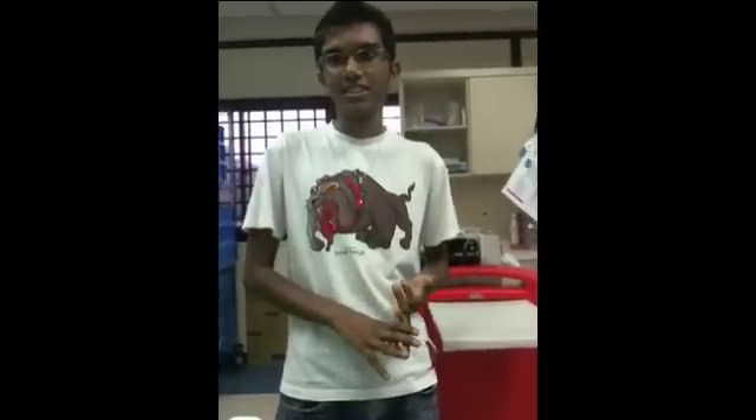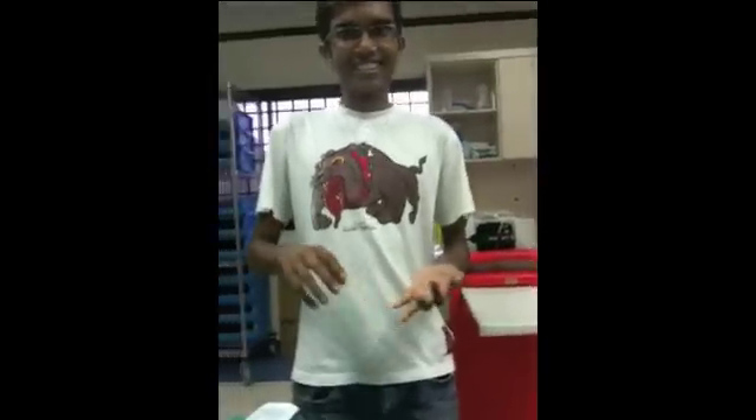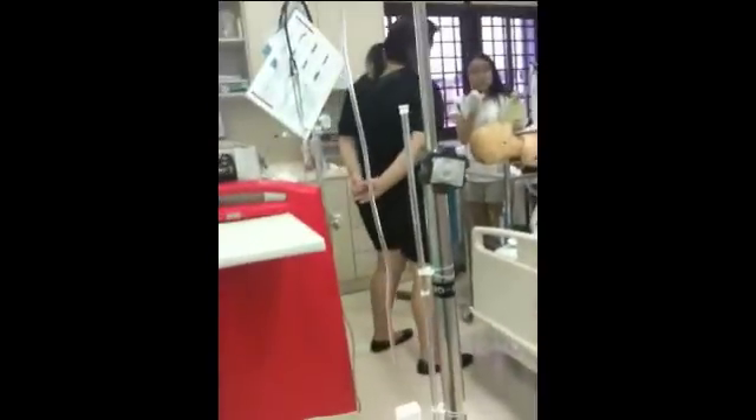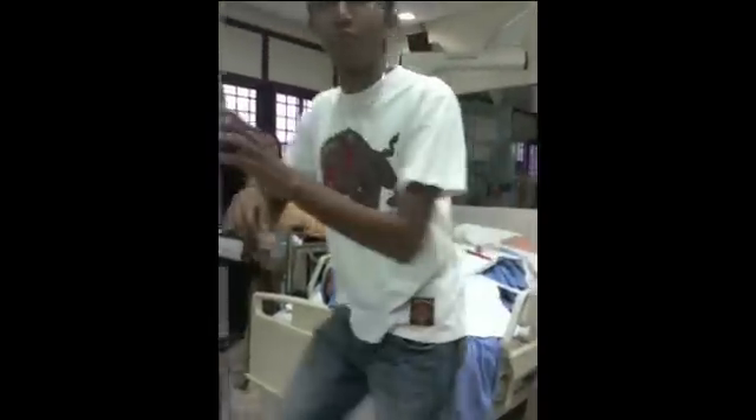After I clear, I need to document. I'll document the patient's vital signs, and for CVP, I need to record the CVP reading with the date and time. That's the documentation: date, time, and CVP reading. And look for any abnormalities.